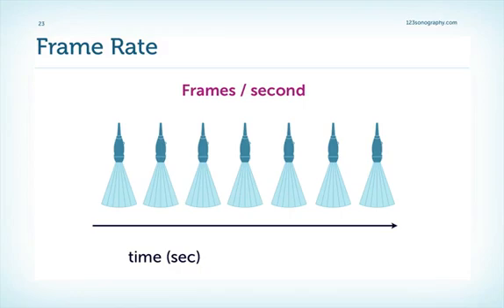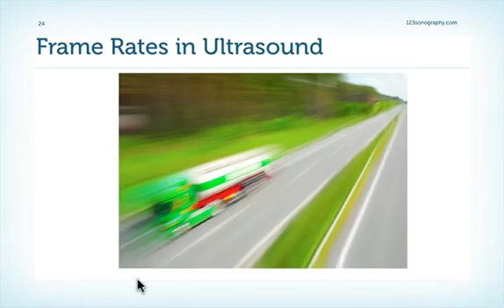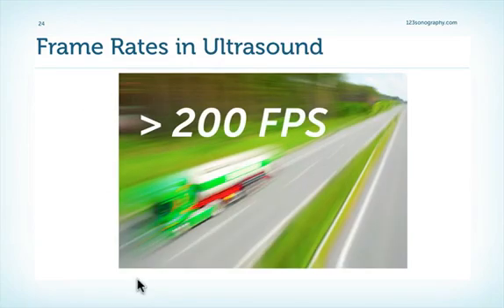Now, frame rate is defined as the number of images, or the number of pictures actually, which are displayed within 1 second. Just to give you a better appreciation, in PAL television we have frame rates of 25 frames per second, while with HDTV we have frame rates of 60 pictures or frames per second. And what can we achieve with echocardiography? Well, frame rates above 200 frames per second, and with experimental ultrasound even more, probably above 2000 frames per second. But the question remains, why do we need such high frame rates in the first place? They're higher or quicker than what our eye is able to grasp. Well, Marion is going to show you now in a demo what it is good for in ultrasound.